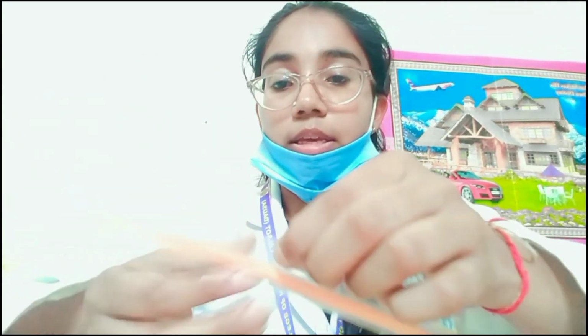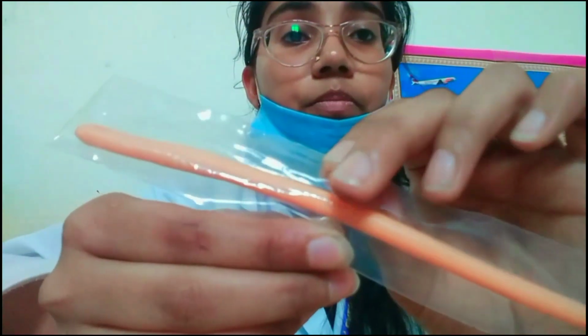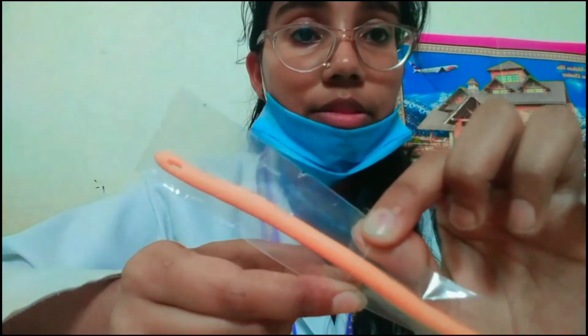So you see here markings. This is marking from here. Open the catheter. Okay. So we open the catheter from here.